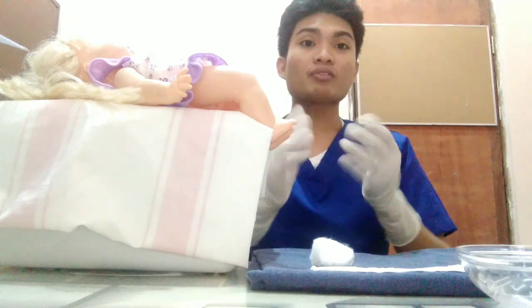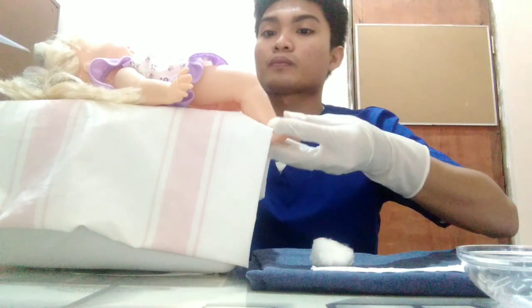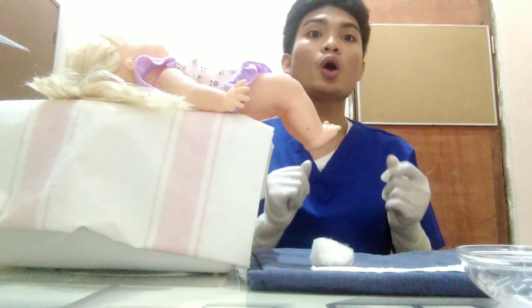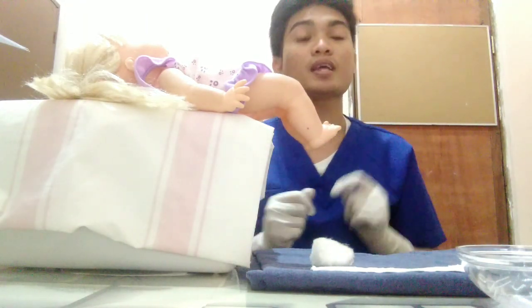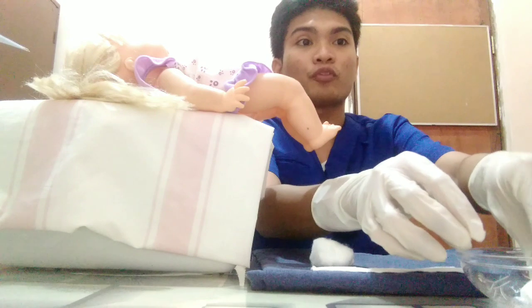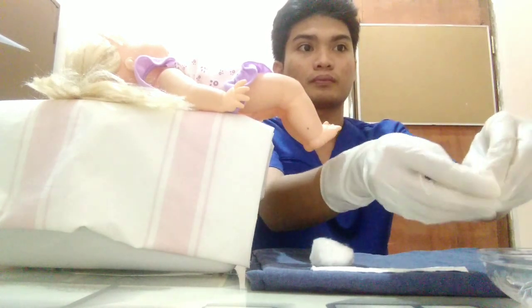So, the feet of the infant should be lower than the heart to facilitate circulation in the periphery or in the lower extremities. So, okay. Now that the patient's feet is already positioned below the heart, we will now be warming the surface of the heel, which is this part, using warm water. We will be doing this for 3 to 4 minutes.